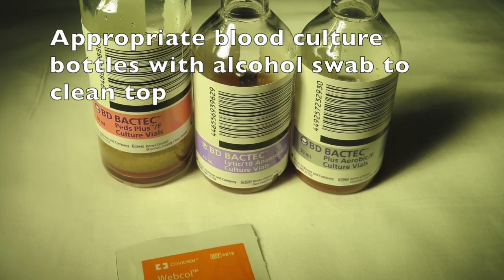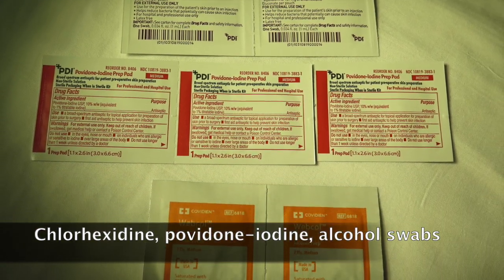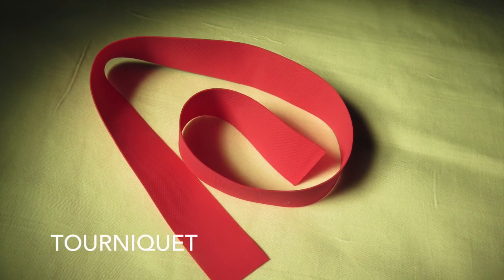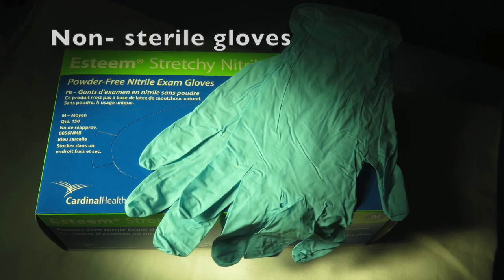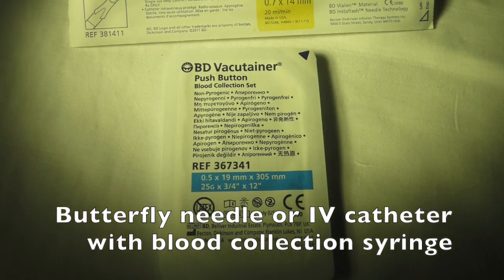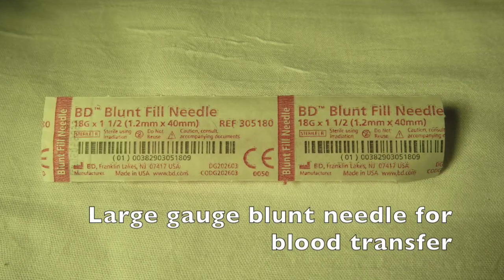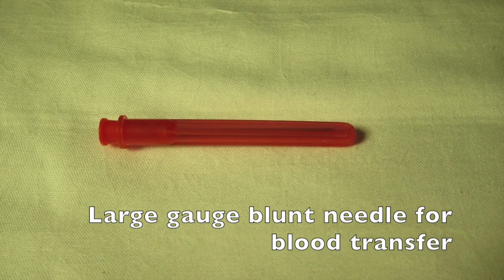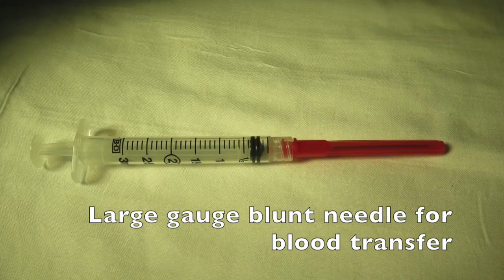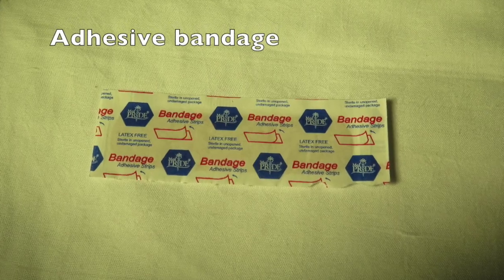Appropriate blood culture bottles and alcohol swabs to clean the top, chlorhexidine, iodine, and alcohol swabs. A tourniquet, non-sterile gloves, butterfly needle or IV catheter with blood collection syringe, a large gauge blunt needle for blood transfer, sterile gauze, and adhesive bandage if appropriate.